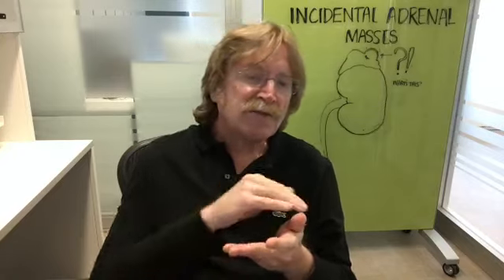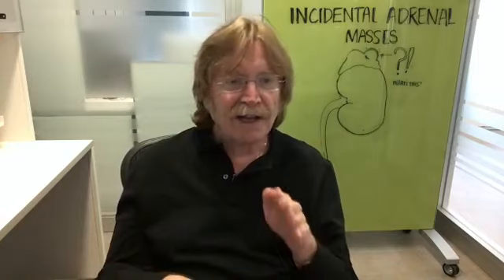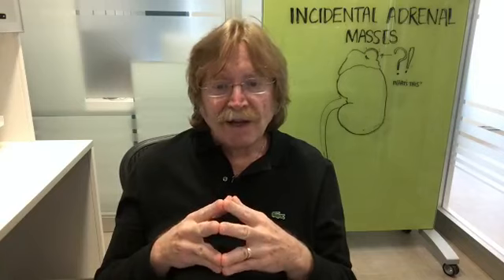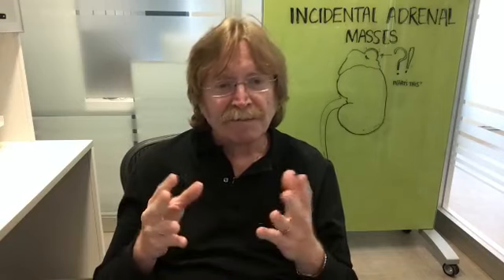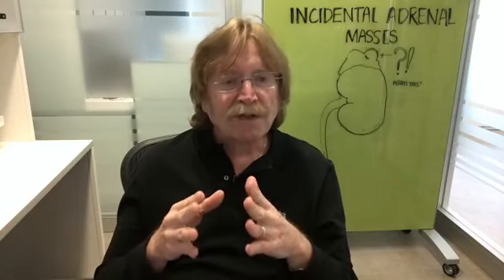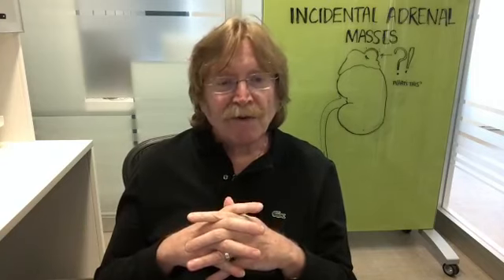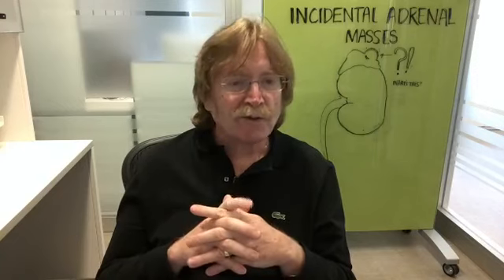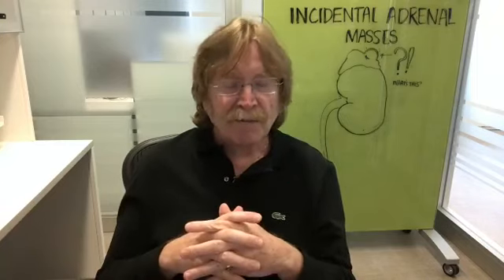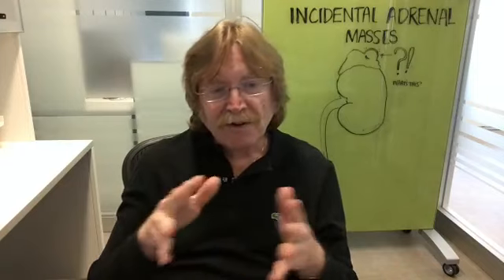What do you do? So it's very important to realize that adrenal lesions will enhance and then they de-enhance. So they enhance and they wash out. And the articles have been very clear over time that washout of greater than 60% is going to be benign, with the one exception. Pheochromocytomas wash out more than 50 or 60%. The thing about it is, with pheochromocytomas, they also enhance more than 120 Hounsfield units on the 60-second images, arterial or venous, but let's say 60 seconds. Adenomas never enhance more than 110. So that's a very simple way of doing it.